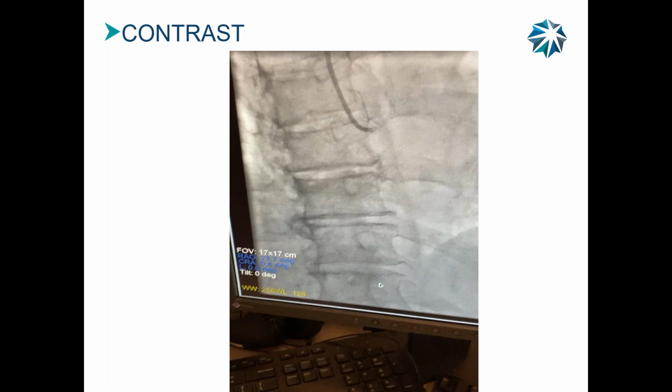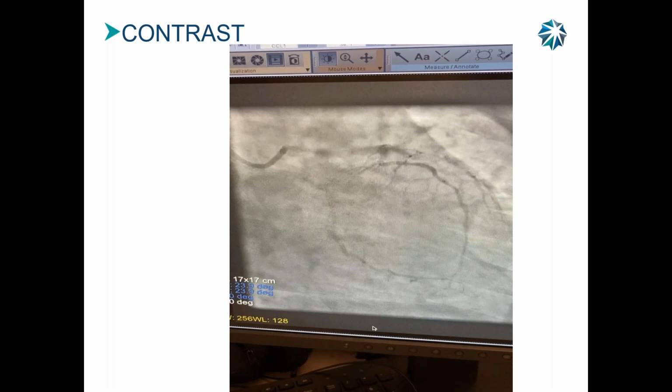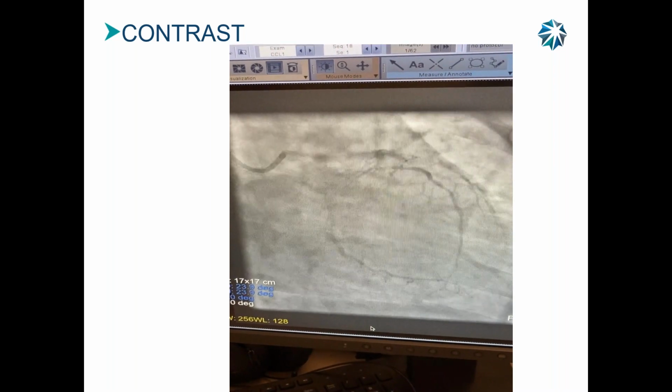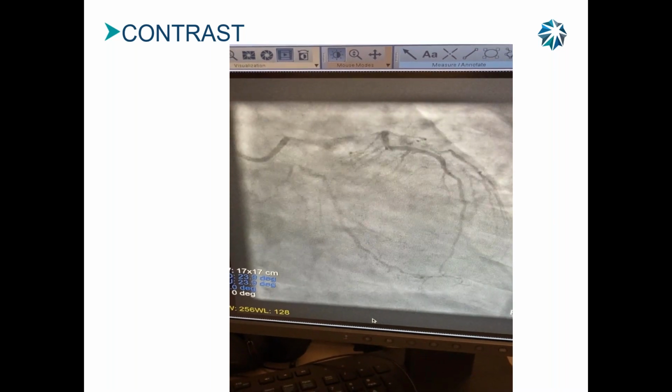The doctors use reverse imaging. So what's white is dark and what's dark is white. Why do they want to do that? Exactly, gives them a better contrast. It's just not a white blob up there. It gives them a better contrast. Exactly. They can see blockages.